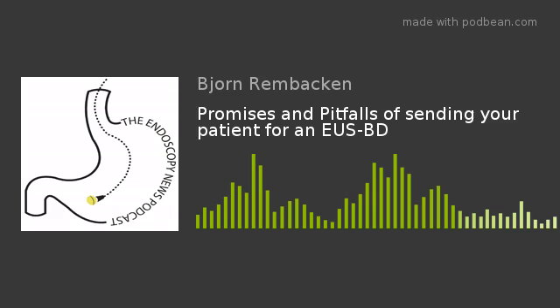of Whipple's pancreaticoduodenectomy. In Leeds, the last time we have gone through our data, 6 of our patients with a CDD stent have gone on to have a resection, and our surgical colleagues have not encountered any particular technical difficulties as a result of leaving that stent in. Similar reports of resectability in patients who've had a CDD with either a lumen apposing metal stent or an old-fashioned self-expanding metal stent have been published in the literature.